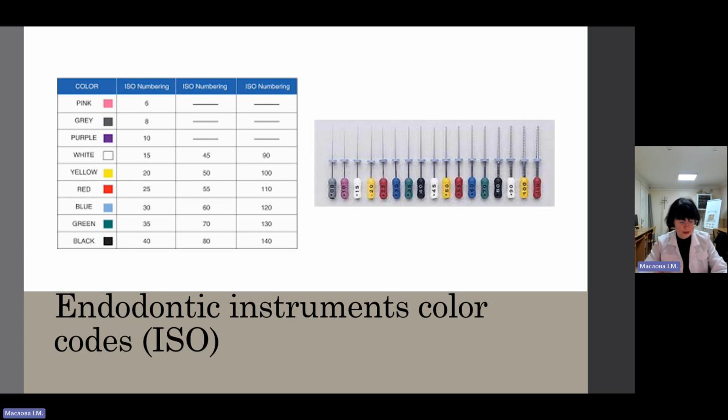Locking tweezers are ideal for handling paper points, gutta percha points, cotton wool pellets, and root canal instruments. Both a broad probe and a periodontal probe are necessary for the initial assessment of the tooth for caries and the localized periodontal condition. A flat plastic instrument and an amalgam plugger are needed for placement of an inter-appointment restoration. A millimeter ruler or other measuring device should be available for measuring purposes. A surgical hemostat may be used to position X-ray film for radiography during treatment.